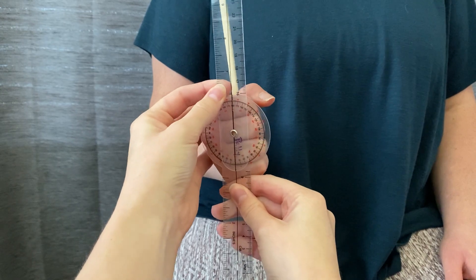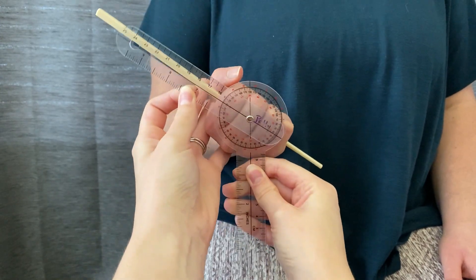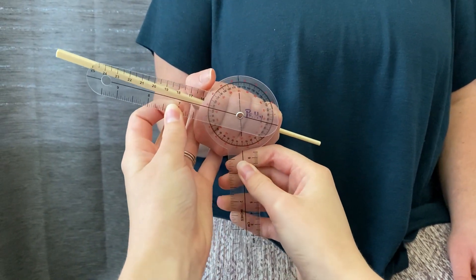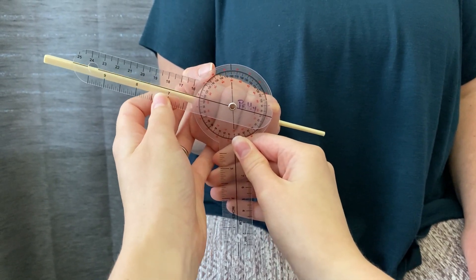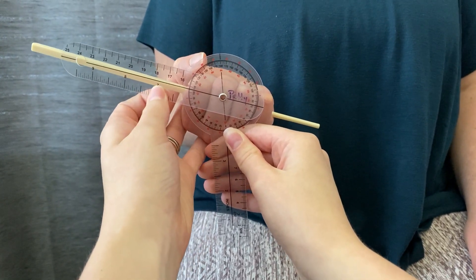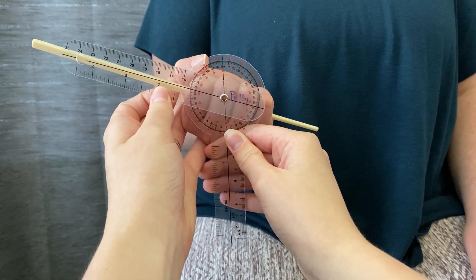Go ahead and go into supination. You want to make sure that the black line is parallel with the object being used.